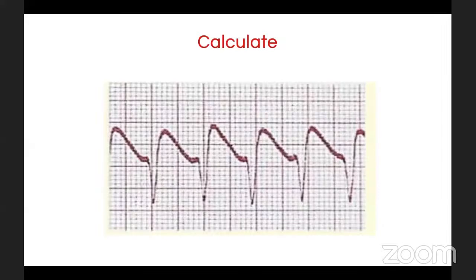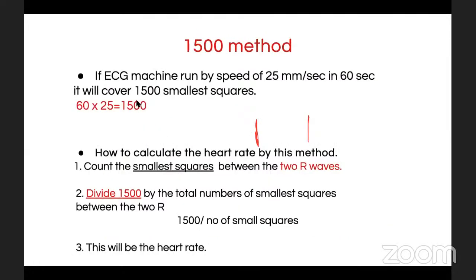إيش قلنا؟ نسهل على نفسنا، ندور أوضح 2R waves. أوكي صح ممتاز، يعطيكم العافية. ممتاز صح، 300 by 2 equals 150. أوكي الحين خلصنا من rule of 300.